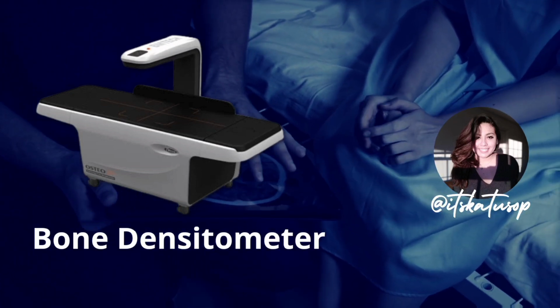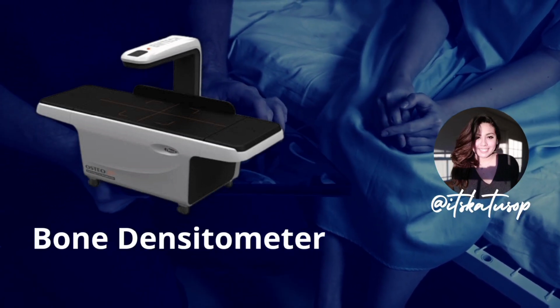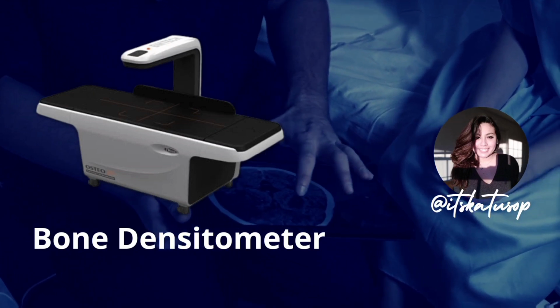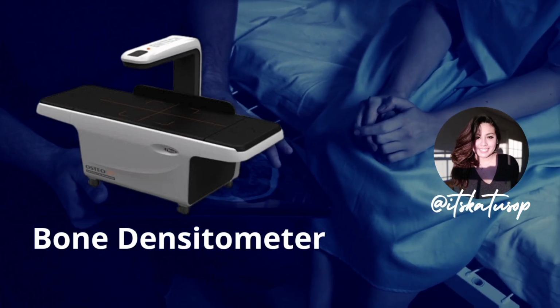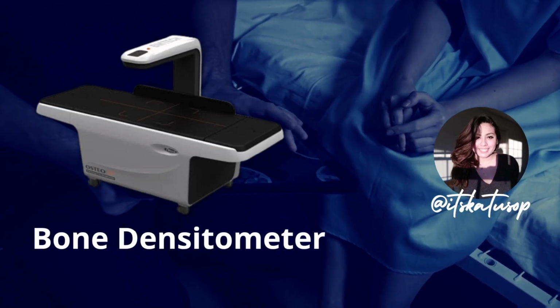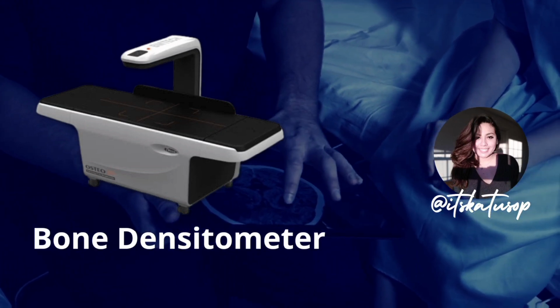These images can then be analyzed to determine the density of the bones, which can indicate the presence of conditions such as osteoporosis. Osteoporosis is a disease that weakens the bones and makes them more likely to break.